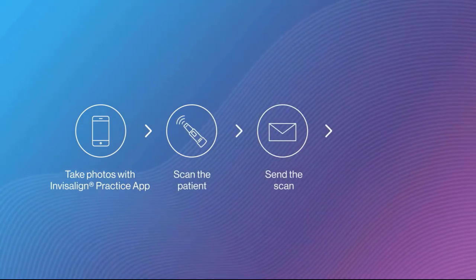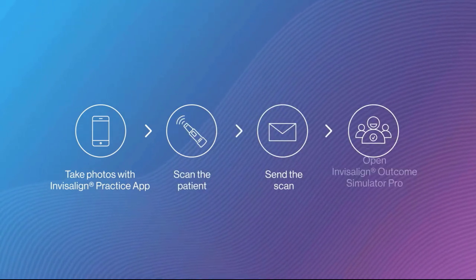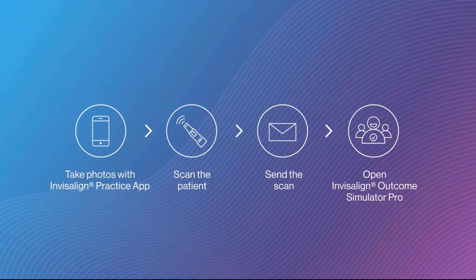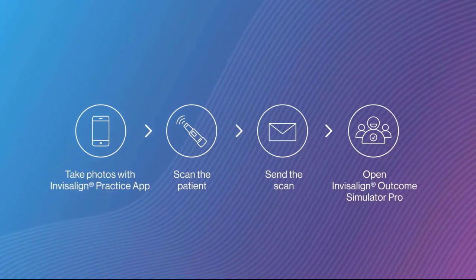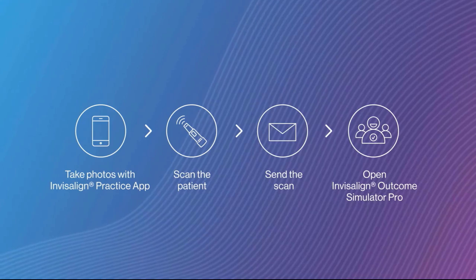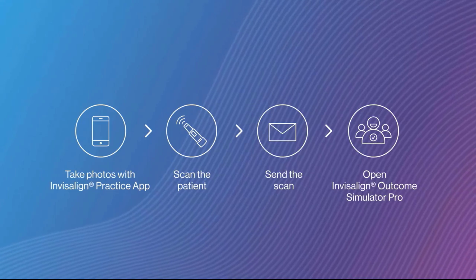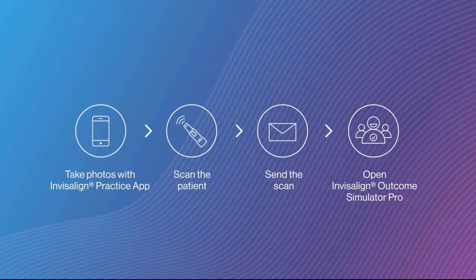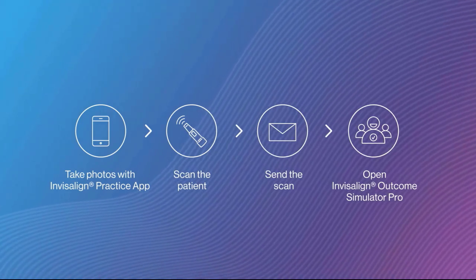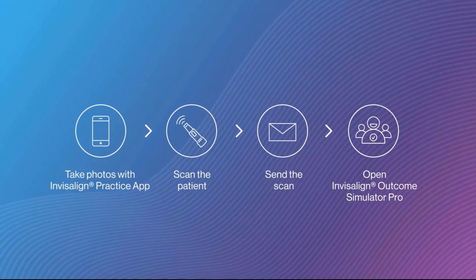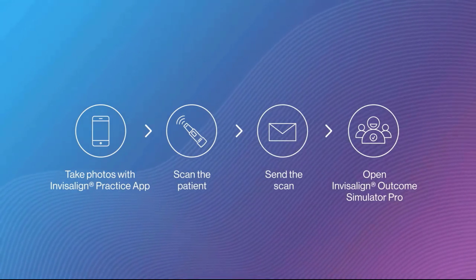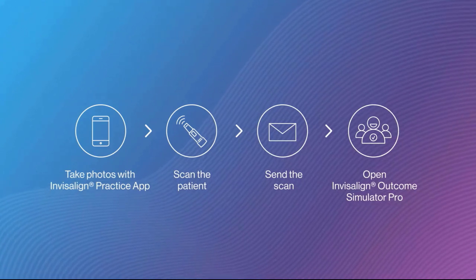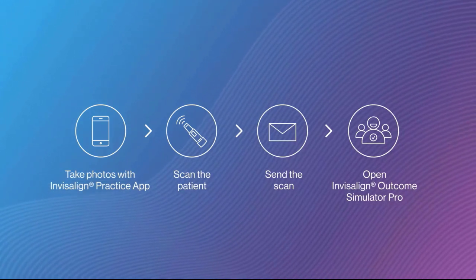First, we'll need to capture the wide smile photo using the Invisalign Practice app and scan your patient. Once you send the scan, the simulation will start automatically. You can use your scanner while the simulation calculates. Open the simulation and show your patient their potential new smile.